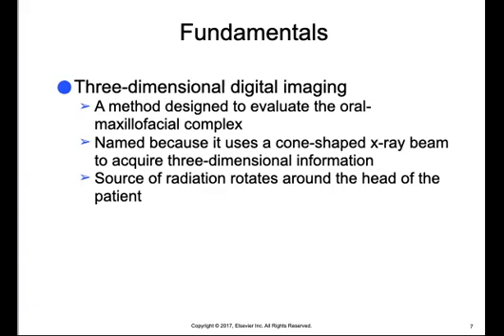The source of radiation in CBCT machines rotates around the head of the patient, just like in a panoramic X-ray. And with CBCT imaging, the region of interest of the patient anatomy is called a field of view.